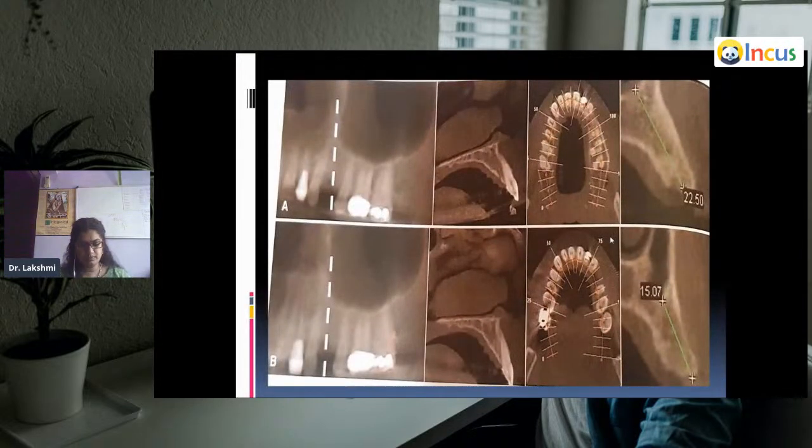In this also, if you can see, reorientation of the sagittal plane to the occlusal plane. This is the reference plane in this one. Here what happens, reformatted panoramic image, or you can call it, can you see this third image from both the top and the bottom line? You have many different lines over here.